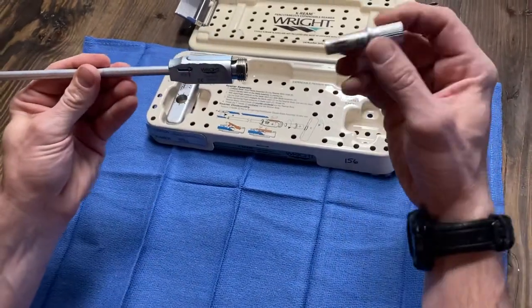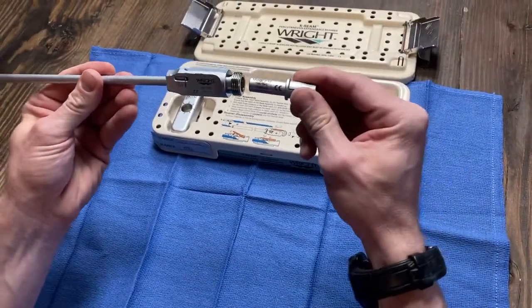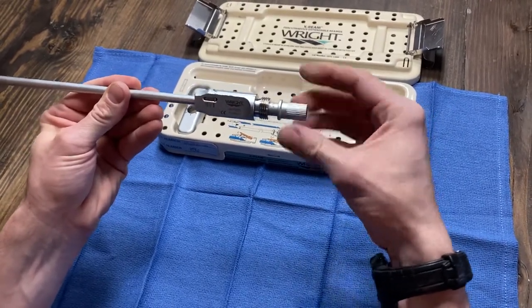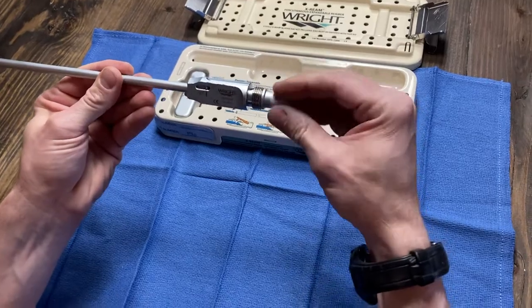Next you take this control knob. This is reverse thread — threads into the back here. Reverse thread, so counterclockwise all the way in until you're down.